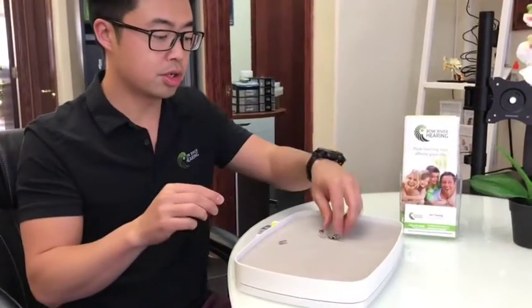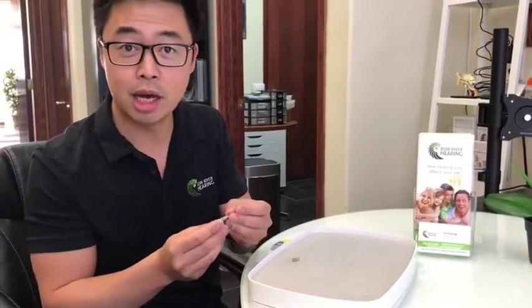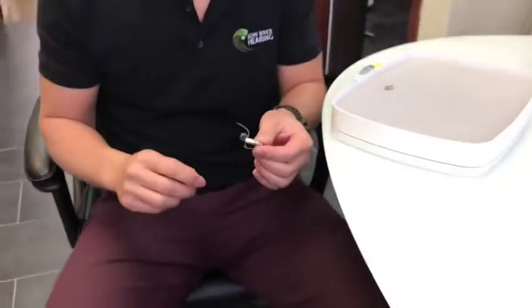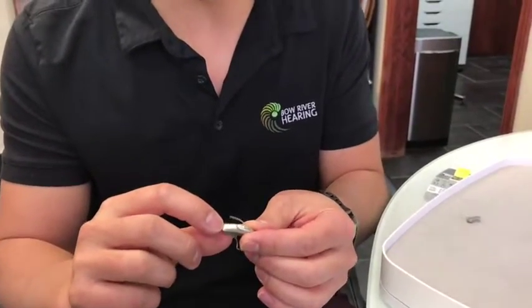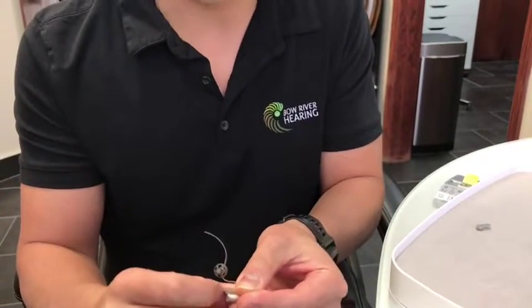To get started, I have a set of our new Phonak B90s here. First, what we'll do is take the battery out. As you can see here with the RIC hearing aids, we're going to pull on this little tab at the bottom, and when you pull on it the door is going to open.